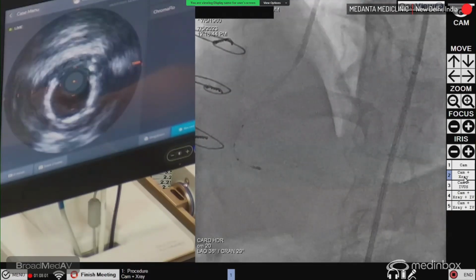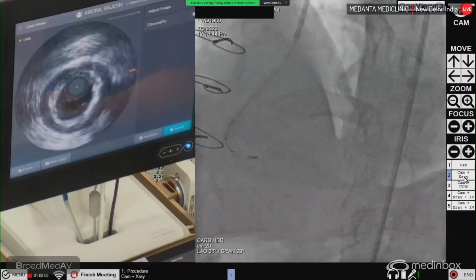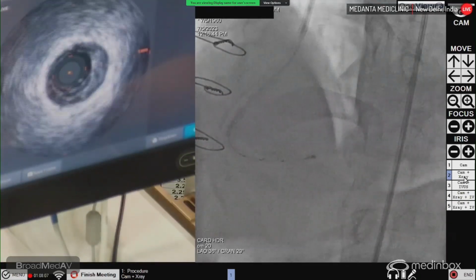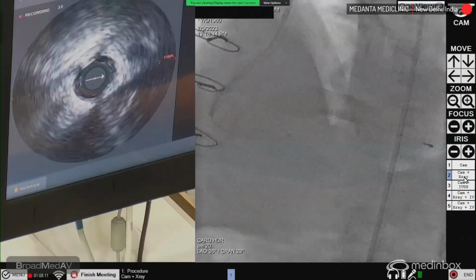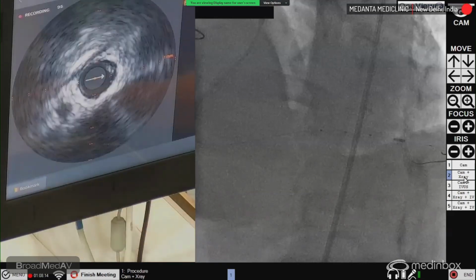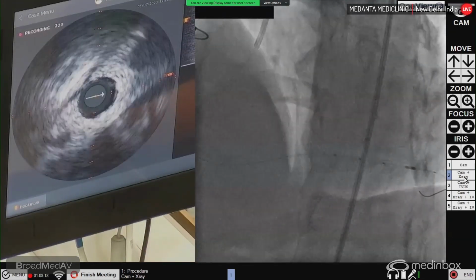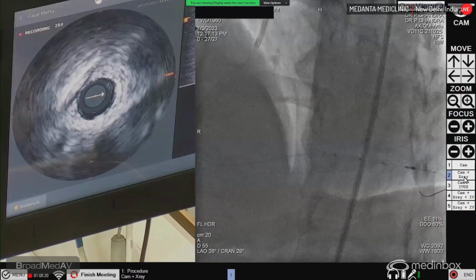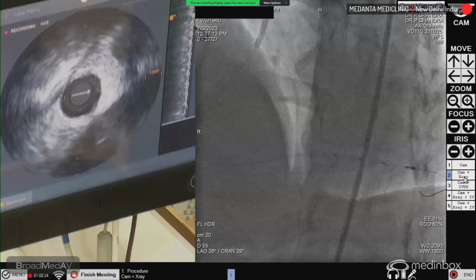So now I'll push the guide +2 catheter a little bit inside, which moves very easily, and I have crossed the stent. Okay. So now I'll pull back the guide +2 back again, because I don't want this continued ischemia. Okay. So I'm pulling it back. Now look at the IVUS. Yeah.